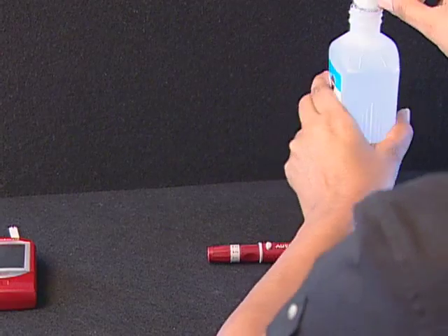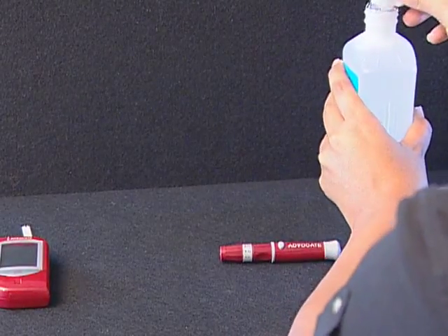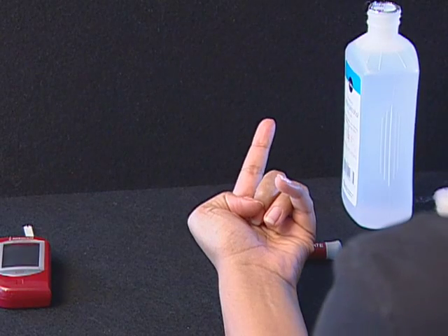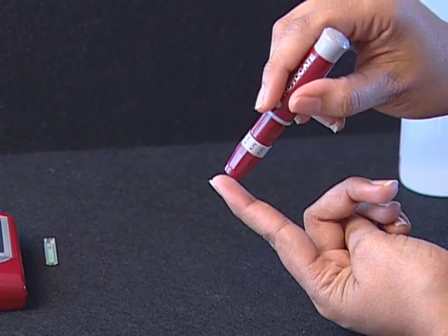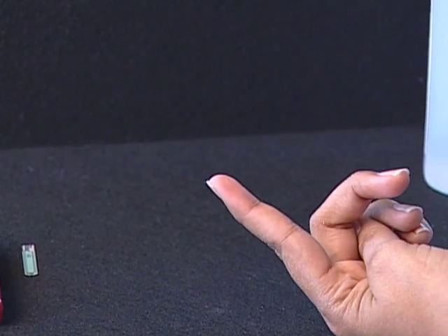Step 3: Get a drop of blood. Select the puncture site either in the finger or as shown later in other parts of the body. Clean the puncture site with 70% alcohol cotton and let it air dry. Hold the lancing device firmly against the side of your finger and press the release button. You will hear a click indicating that the puncture is complete.